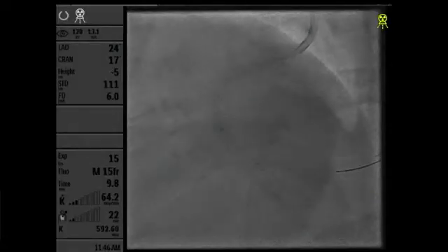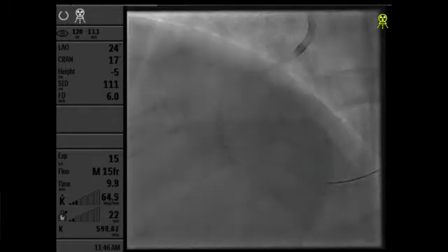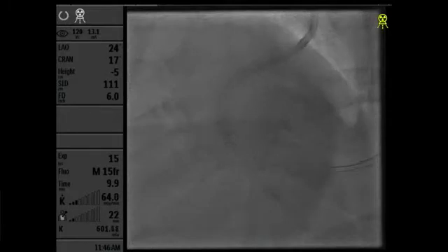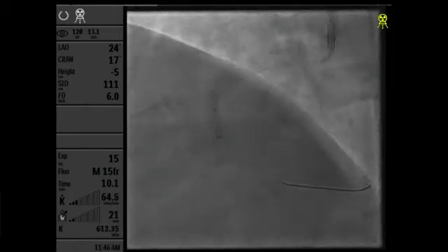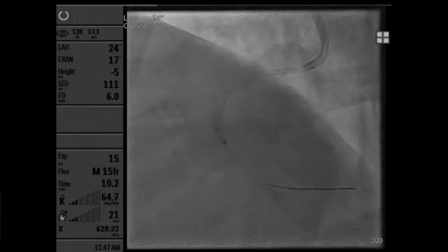Let's go up again, please. What do you need? Go up again. Yeah, we should leave it. But I believe that you're dilating the whole vessel, and then IVL will be a good way. The guideliner advanced forward. I think you're stuck on the nodule here. Yeah, I'm stuck on the nodule. I don't think it will move forward anymore. I think the shockwave will go now.